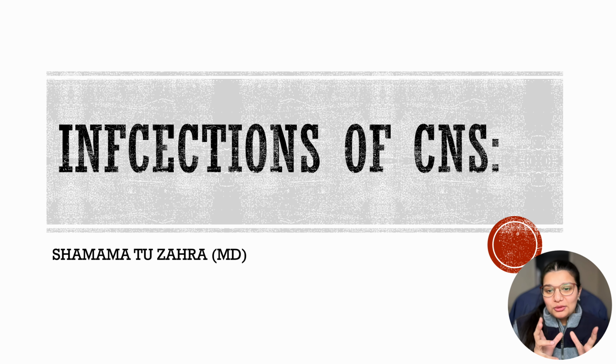So, it's always cool when we see organisms under the microscope, and I personally get very fascinated and I enjoy that. Not good for patients, but we, being pathologists, enjoy it. So, let's dive in. That's our topic today.